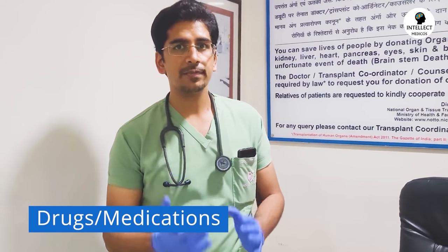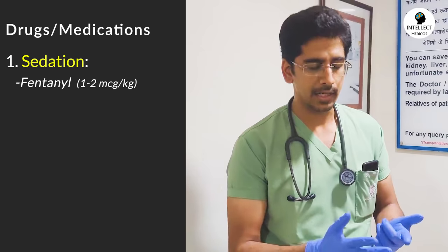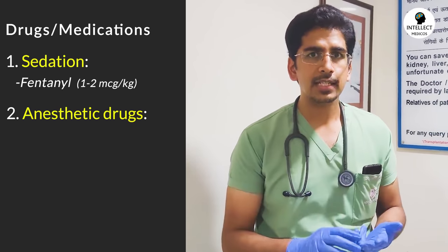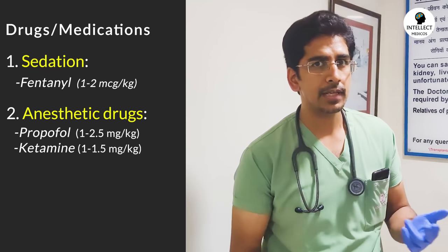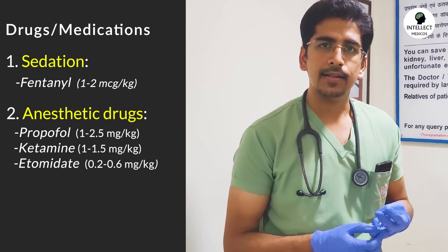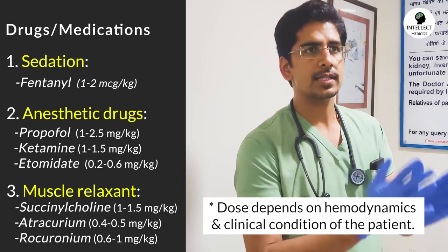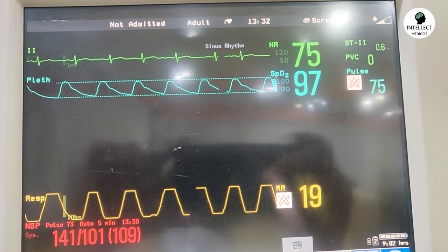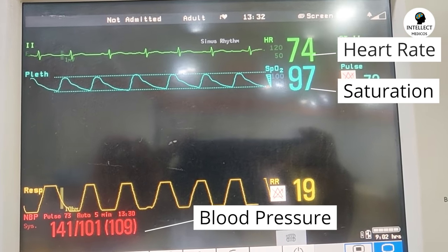Before the procedure, we discuss drugs used prior to intubation. First, sedation — we prefer fentanyl (an opioid); morphine can be used instead. Second, an anesthetic drug — commonly propofol, but since propofol causes hypotension, ketamine or etomidate may be selected based on the patient's vitals. Third, relaxants — either succinylcholine or atracurium; vecuronium is not preferred due to its long-acting profile. Throughout the procedure, monitor heart rate, blood pressure, and saturation — ask nursing staff or a colleague to watch the monitor.